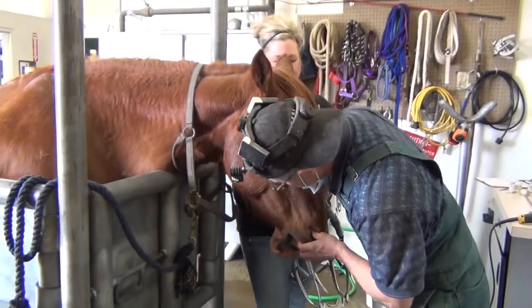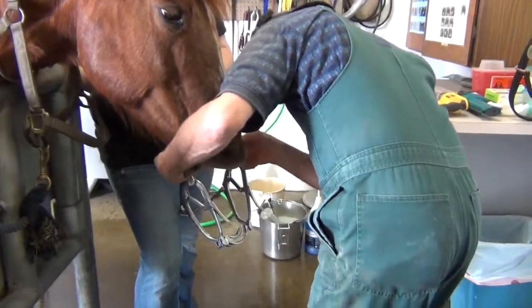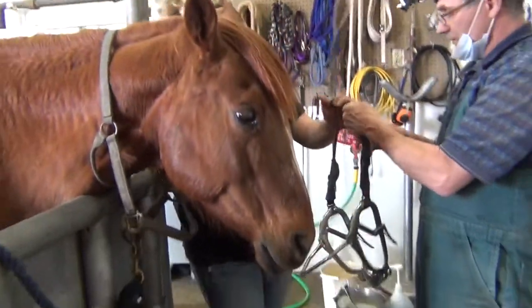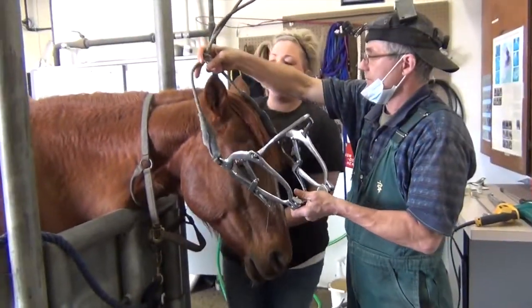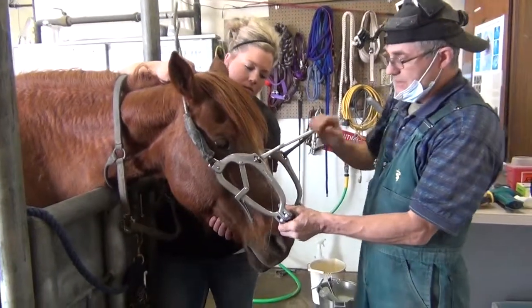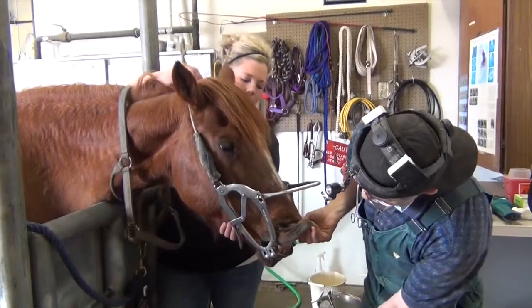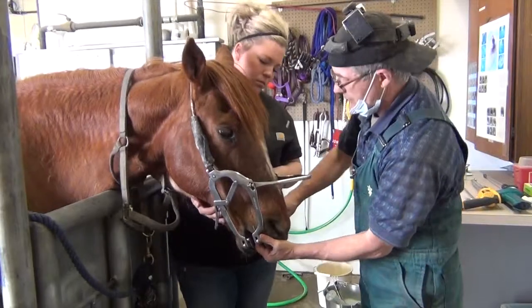And then I also take a look at her lips and the front of her mouth, again looking for any injuries or scar tissue or tumors. And then we use this full mouth speculum. So we take their halters off and put this on these incisor plates. These fit right on the incisor teeth, and then we can ratchet the mouth open. So I just place this on her incisor teeth like so, and then we can ratchet the mouth open.